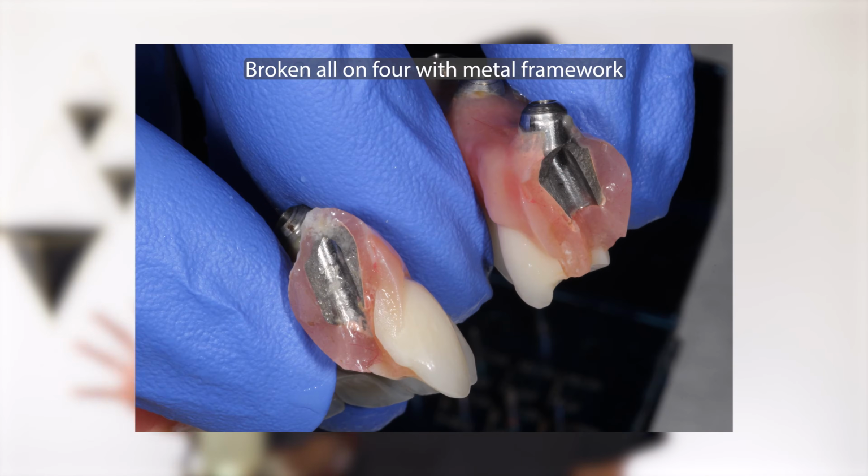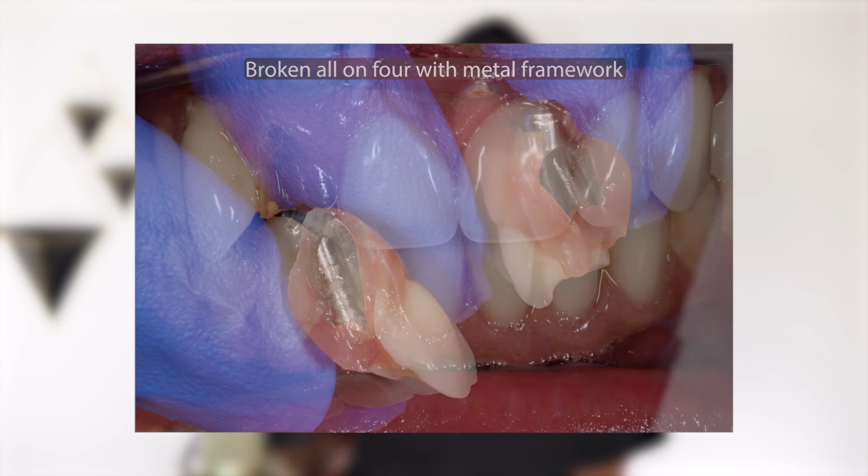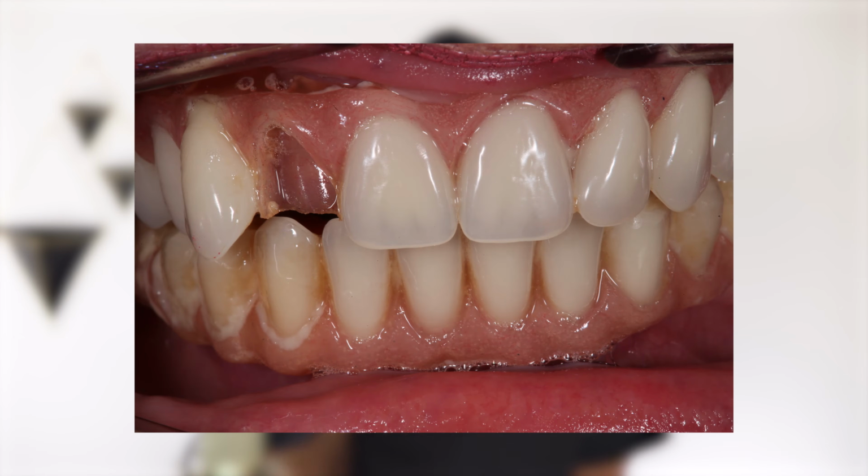When I talk about our full fixed solutions, there are a number of different materials that we can use. We can have kind of like a metal skeleton with acrylic teeth over the top of it, which are great. Probably about 70% of the patients we treat have this. The downside to this is that occasionally a tooth can chip off. Okay, and this comes in from a functionality point of view. Okay, it's annoying when that happens.